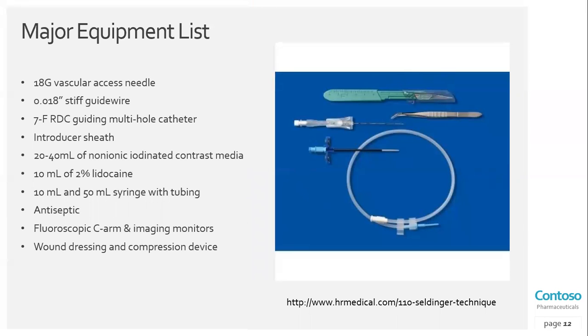So, major equipment list. This is a very specific list, but let's go ahead and go through it.